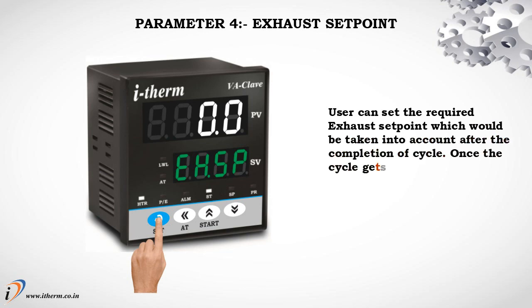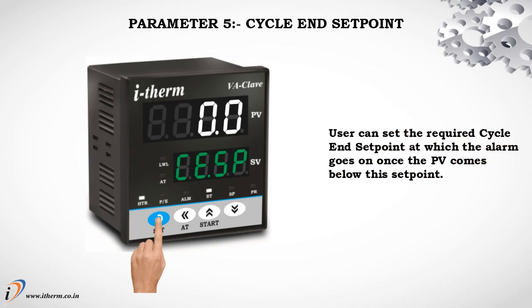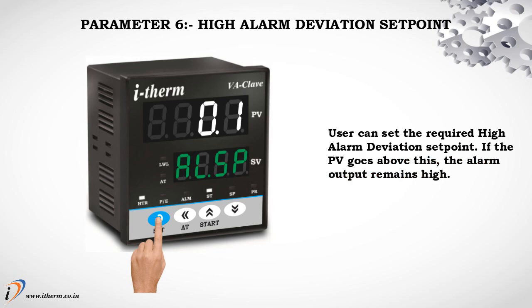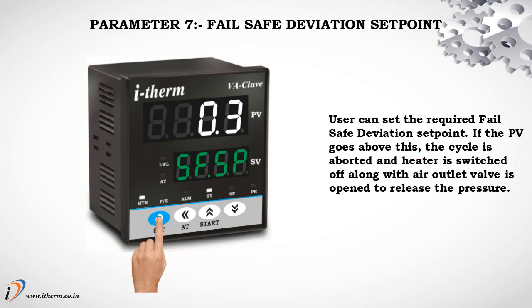Parameter 4: Exhaust Setpoint. The user can set the required exhaust setpoint which would be taken into account after the completion of the cycle. Once the cycle gets over, the exhaust output remains on until the exhaust setpoint. Parameter 5: Cycle End Setpoint. The user can set the required cycle end setpoint at which the alarm goes on once the process value comes below this setpoint. Parameter 6: High Alarm Deviation Setpoint. The user can set the required high alarm deviation setpoint. If the process value goes above this, the alarm output remains high. Parameter 7: Fail Safe Deviation Setpoint. The user can set the required fail safe deviation setpoint. If the process value goes above this, the cycle is aborted and the heater is switched off, along with the air outlet valve opening to release the pressure. This is the last parameter of the user list. Press Set key to enter run mode.